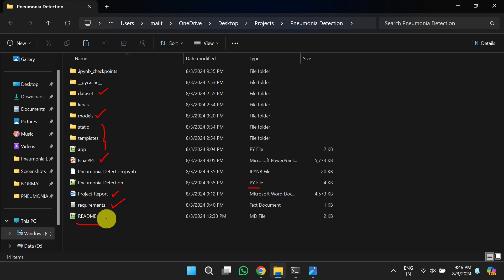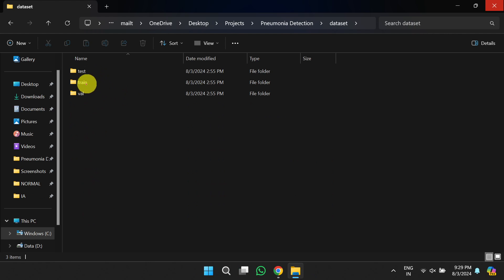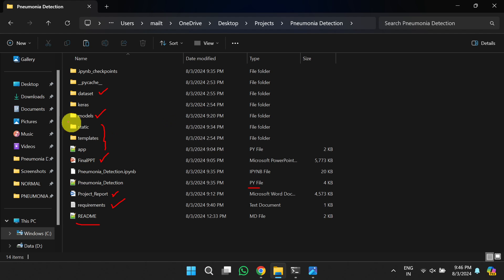Once you follow the README file, you will be able to understand how to set up and execute this project. The dataset contains three folders: test, train, and validation. Within each of these, there are two more folders: one is 'normal' and another is 'pneumonia'. The normal folder contains all X-rays of normal persons, and the pneumonia folder contains X-rays of persons with pneumonia.